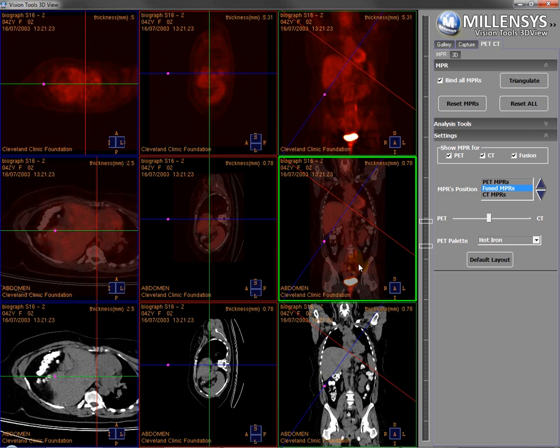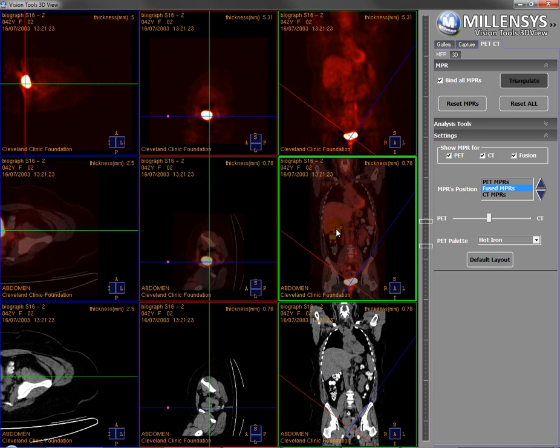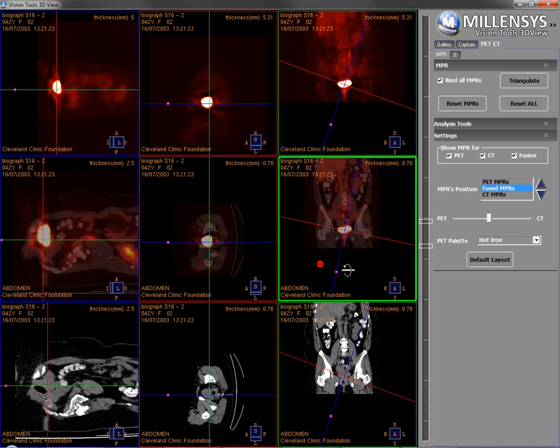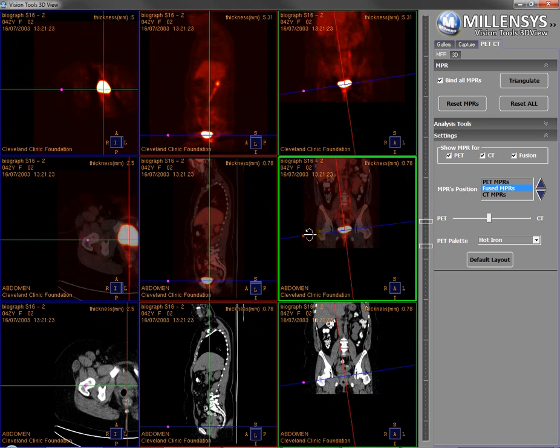Another important tool in the MPR is the triangulation tool. The triangulation is available here or by pressing Shift while pressing the left click. Let's try to triangulate the views on this region right here. When I triangulate, all the MPR axes will point to that view, so I can visualize it from any angle.